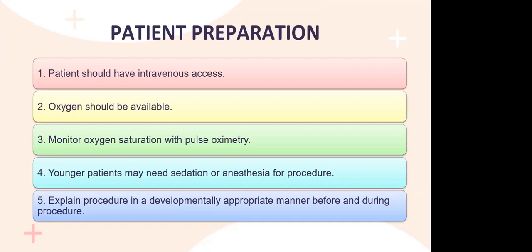Okay, for the patient preparation, intravenous access and oxygen should be available. We monitor the saturation with pulse oximetry and the patient's vital signs, and we need to explain the procedure to the patient.